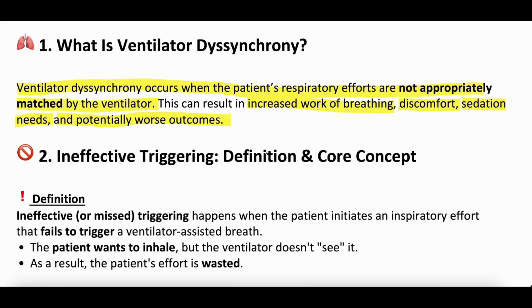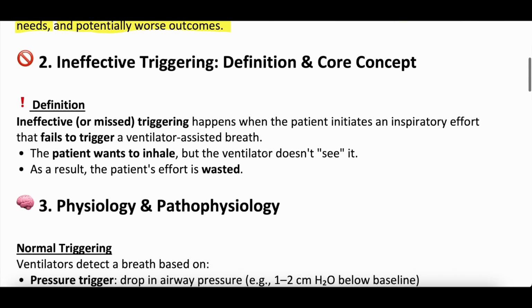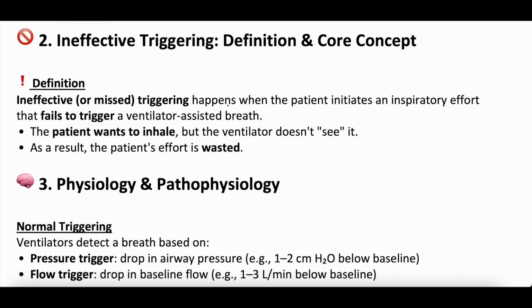What about ineffective triggering specifically? Definition and core concept. Ineffective triggering happens when the patient tries to initiate a breath. They initiate an inspiratory effort, but that actually fails to trigger a ventilator-assisted breath. So the patient wants to inhale, but the ventilator doesn't see it. It doesn't pick it up, so it doesn't give a breath. As a result, the patient's effort is wasted. They tried to take a breath and no breath was given.